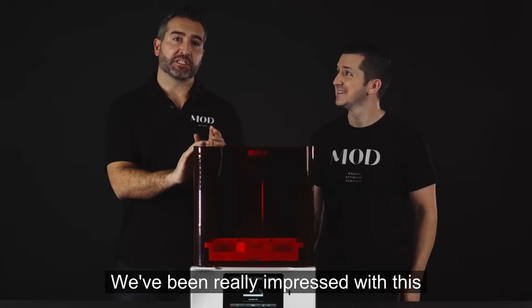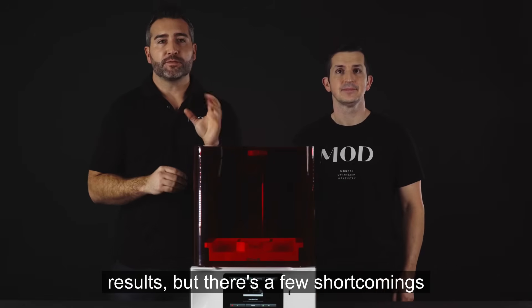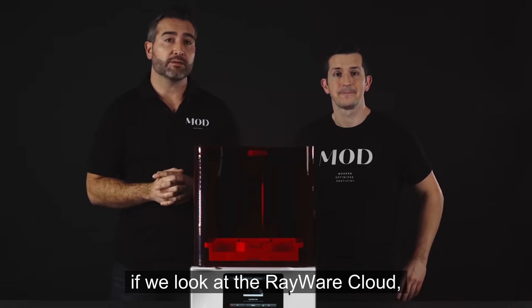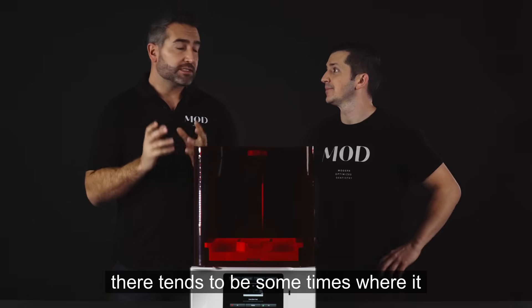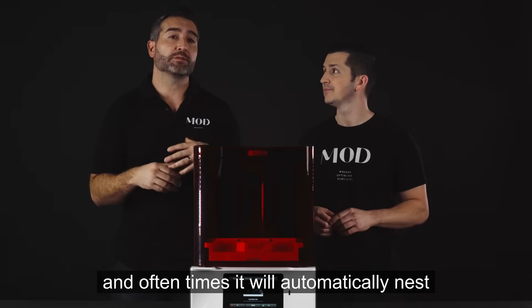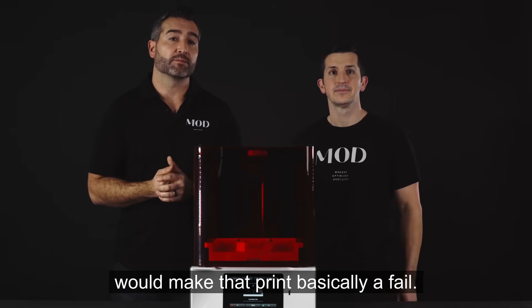We've been really impressed with this printer and getting really good results. But there are a few shortcomings we have to mention. Number one, if we look at Rayware Cloud, there tend to be times where it can be a little buggy and laggy, and oftentimes it will automatically nest a print in the wrong orientation, which would make that print basically a fail.